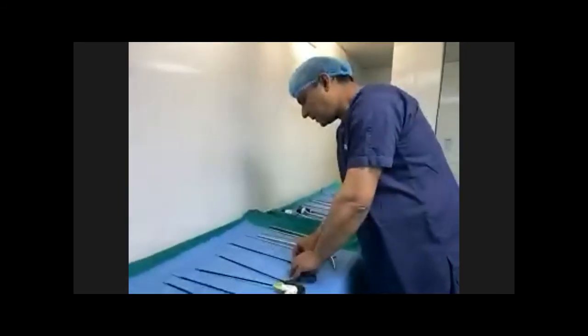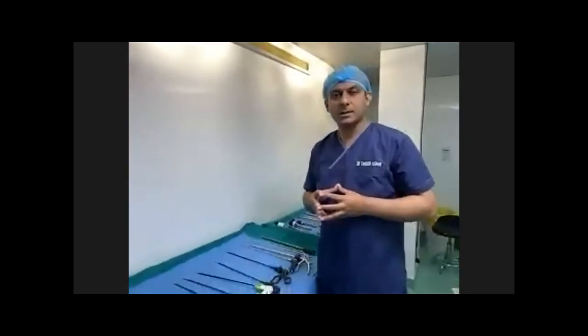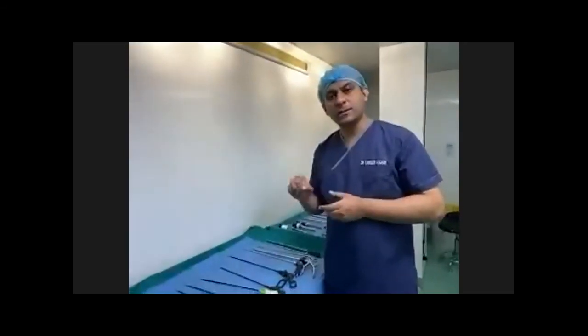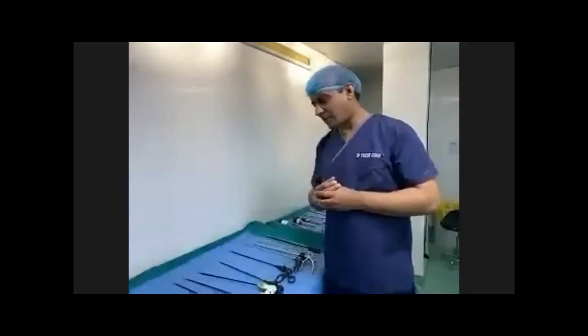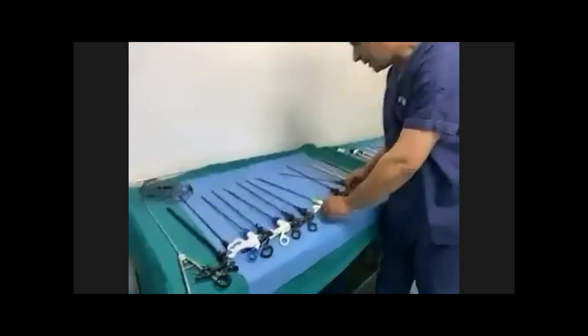The other important instruments are endograspers. The endograspers are of different types. They can be atraumatic endograspers like Babcock's. They can be traumatic endograspers to have a big bite and strong grip. They can be single action endograspers like Johann's. They can be double action endograspers. And there are some other specialized types of endograspers. I'll give you a brief account of the endograspers with locks and without locks.